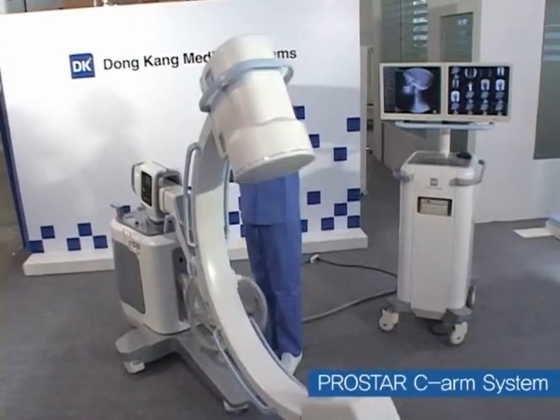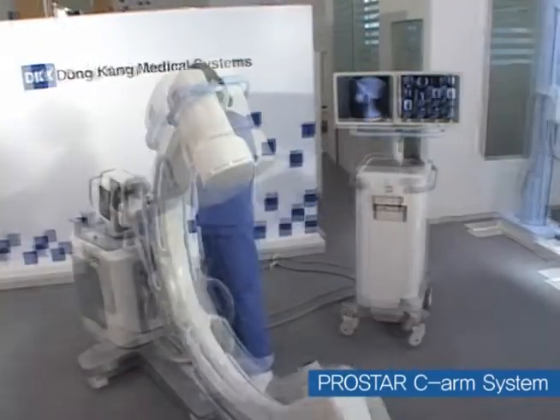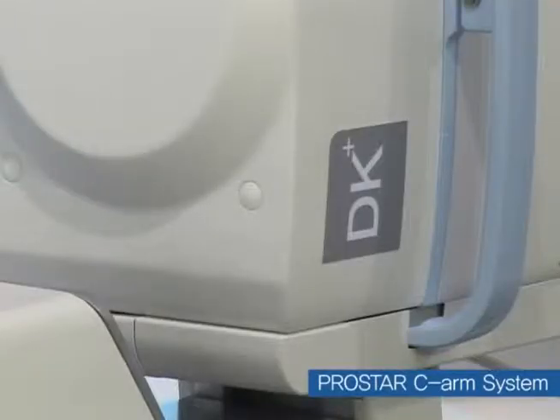The separate main C-Arm and viewing cart enables operators to obtain images easily, and a 1M graded camera is installed for high resolution imaging.